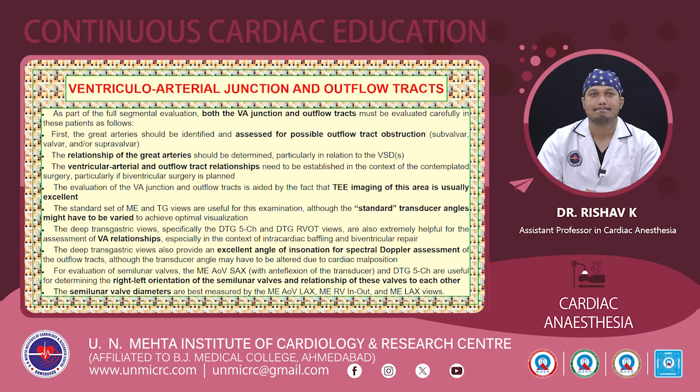Now coming to the ventricular arterial junction and the outflow tracts, this is yet another important part of the full segmental evaluation. At first, we must identify the great arteries and we must assess them for possible outflow tract obstruction, and the relationship of the great arteries should be determined, particularly in relation to the VSDs. The ventricular arterial and the outflow tract relationships need to be established in the context of the contemplated surgery, particularly if biventricular surgery is planned.